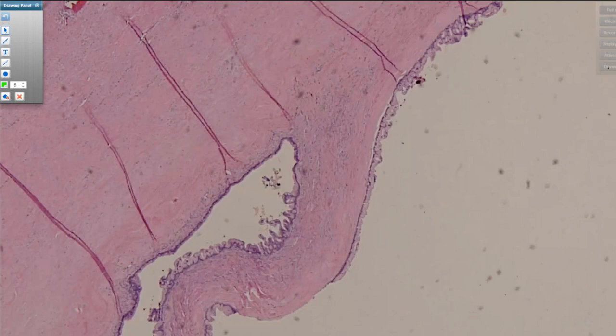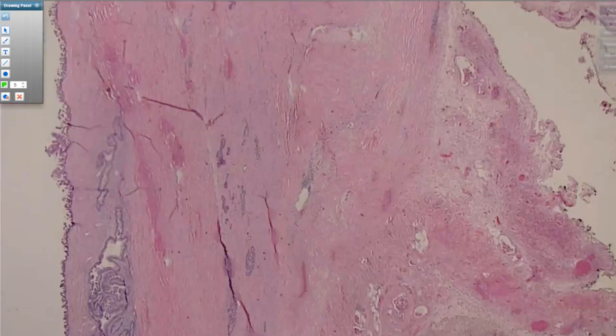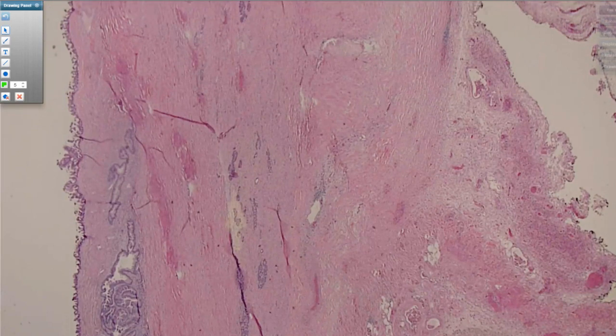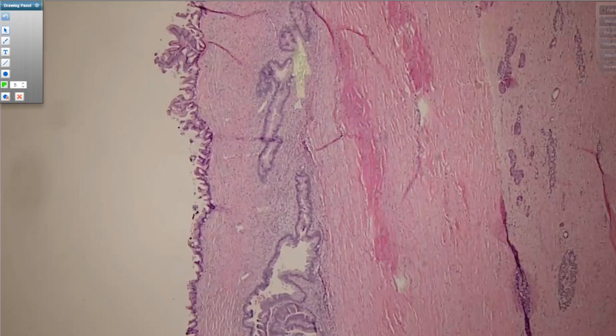And again, you can see a totally bland epithelium there, and it can really abruptly switch to this much more complex, higher grade dysplasia adjacent to it. Because MCNs also have so much associated degeneration and fibrosis, they're very prone to entrapping normal pancreas as well as having funny budding of the cyst itself that can sometimes be confusing and concern people in terms of invasion. So you often see lots of budding underneath, but it's helpful to see how that ovarian stroma is still surrounding all of that, and there's otherwise no reaction to it.